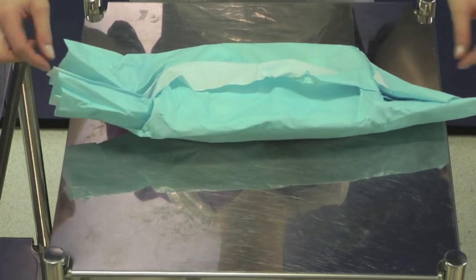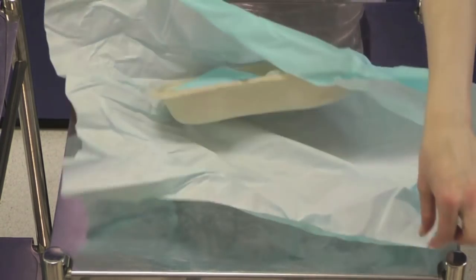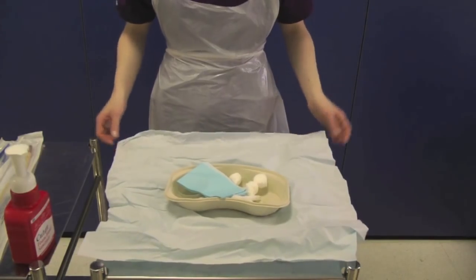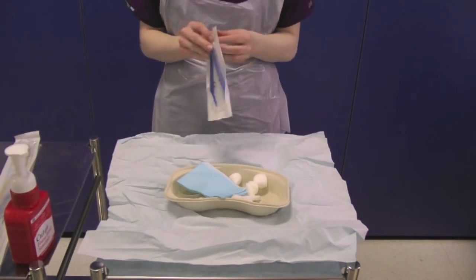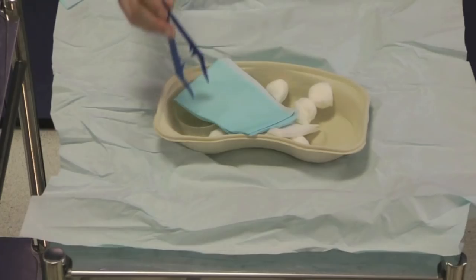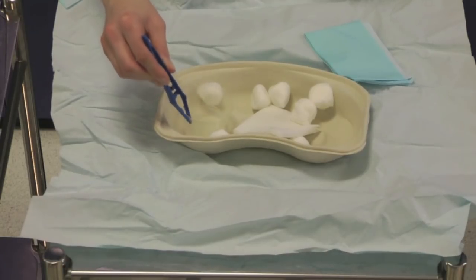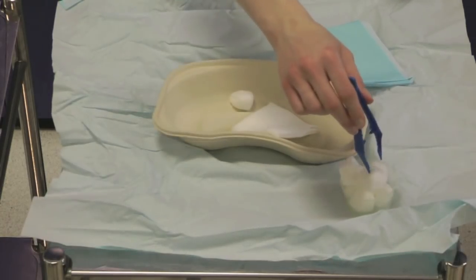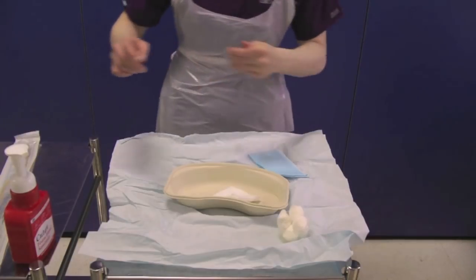Carefully open up the sterile catheter pack. You should open the pack away from you first of all. Take your sterile forceps and organise the contents of the catheter pack, placing the cotton wool balls into the sterile pot. Discard the forceps into the sharps bin and decontaminate your hands.